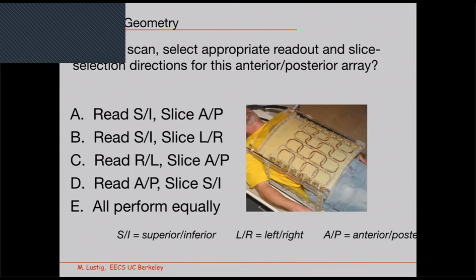So there's a lot of things to consider here. You want to consider acceleration, but you also want to consider field of view. And remember that in the readout direction, the field of view actually comes for free.